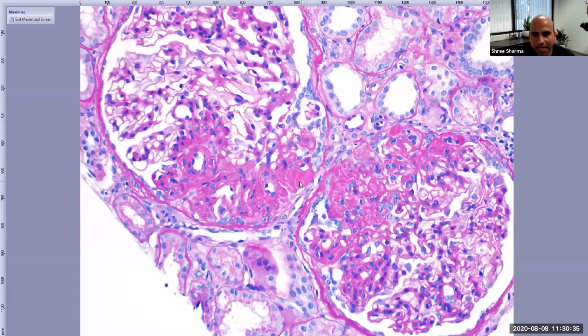Hyaline is this pink amorphous material, almost fluid-like. This pink, you can see some structure to it. This is like fibrosis, like the matrix was. So one is kind of like a lake, almost like a morning lake. Yeah, that's a good term. Glassy. It looks glassy. Yes, glassy, lake-like, a puddle. Basically that's plasma hyaline.